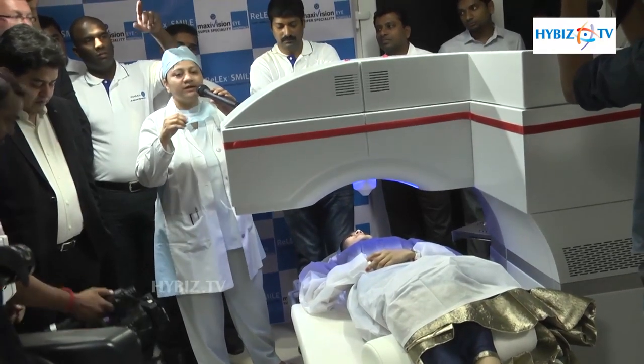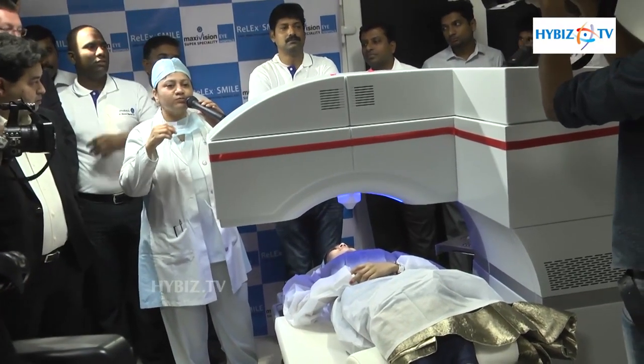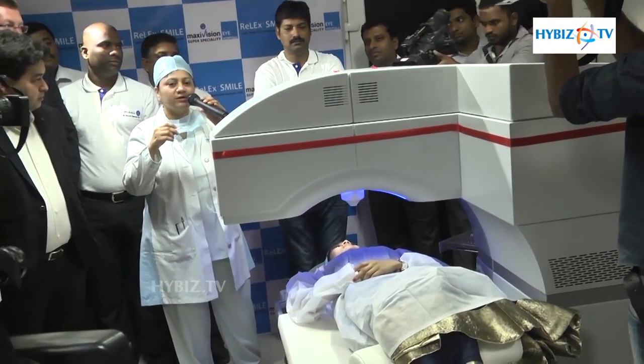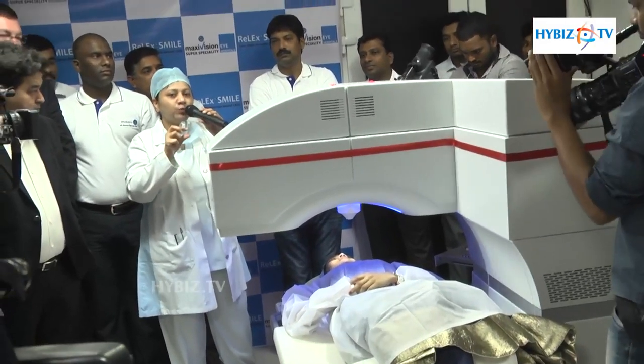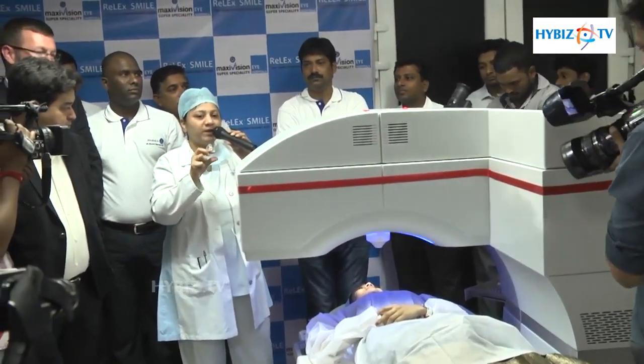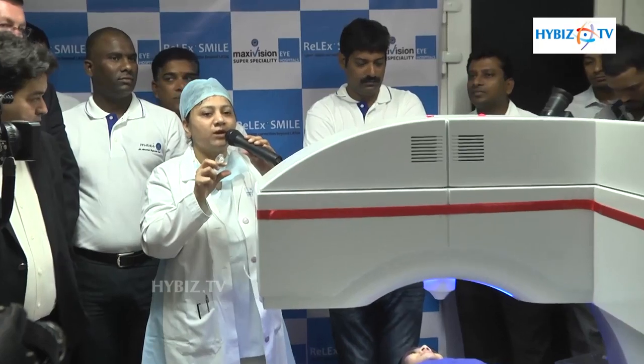This laser will create two planes and one small incision. From this small incision, the two planes which are created will make a small lenticle. And from this small incision, this small lenticle is removed.